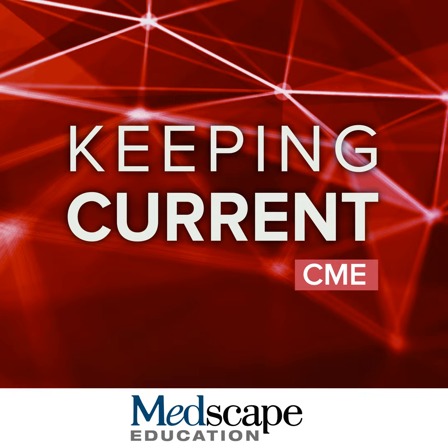There's a much higher enhancement of the background parenchyma so that the vessels appear hypointense, as opposed to what we usually are used to, having hyperenhancing vasculature with respect to the background parenchyma. So again, the arterial and portal venous phase appearances are going to be very, very similar, and the stark differences are going to be starting around 3 minutes after contrast injection.